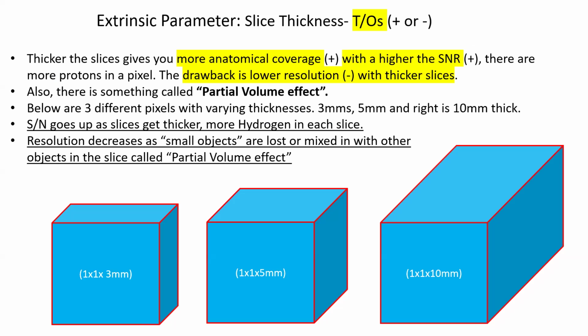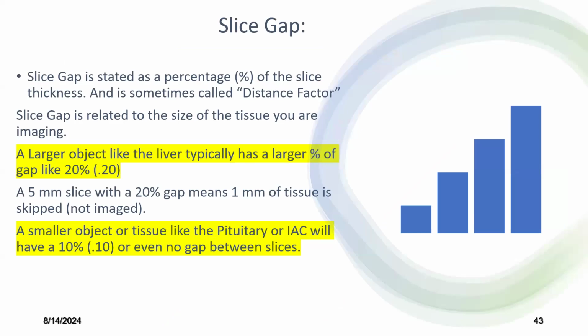So it's an average of all the signals within the voxel. And remember, when you're talking axials in the brain, those pixels, they're actually voxels because they have a slice thickness. They have a left to right, like say 1 by 1, but if there's a slice thickness, that's a voxel, even though you're not doing 3Ds.